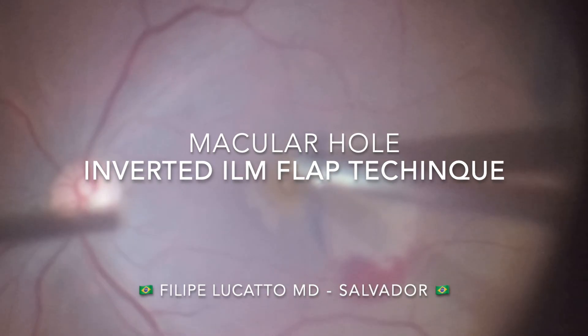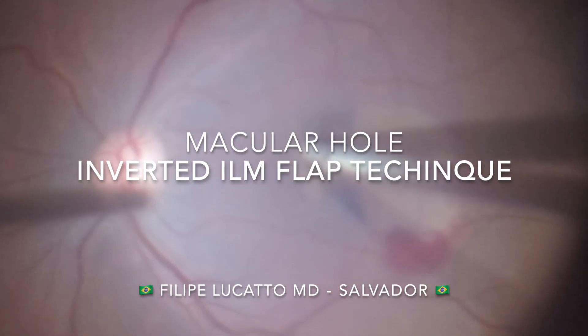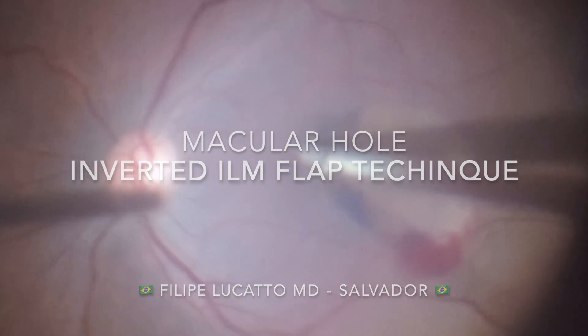In this video, we discuss surgical tips for the inverted ILM flap technique used in the treatment of macular holes.